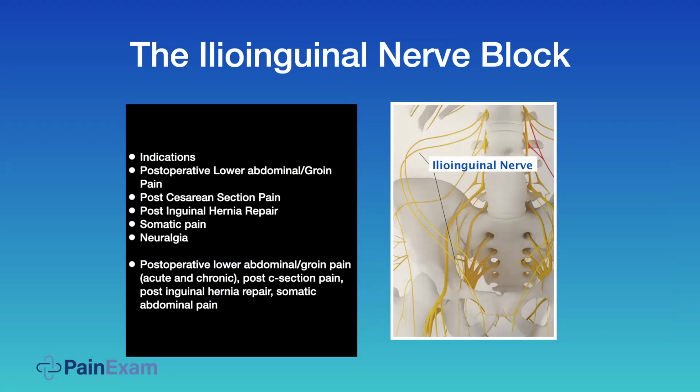The ilioinguinal nerve indications: lower abdominal groin pain, C-section pain, postoperative inguinal hernia, or perioperative repair. That's why I typically treat in my office. Somatic pain, ilioinguinal neuralgia for various reasons.